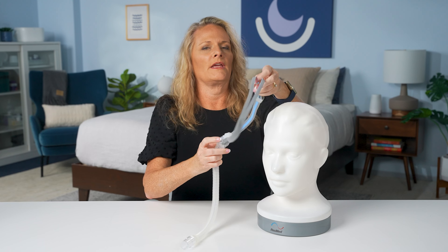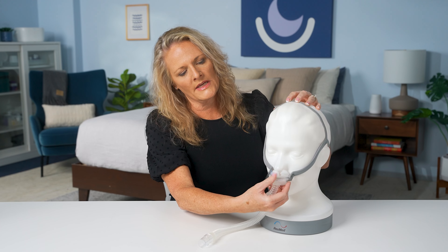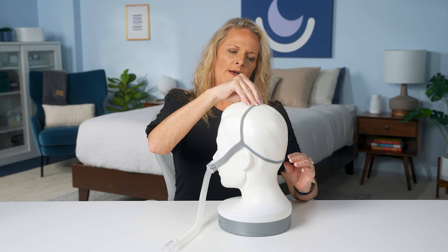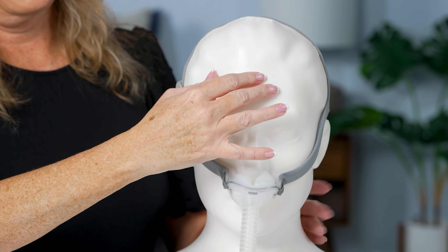Now let's go over how to properly fit a nasal pillow mask on your face. First, position the nasal pillows at the entrance to the nostrils. On this mask in particular, it indicates left and right and shows your size at the bottom, so always make sure the size is down towards the chin. Place the pillows at the entrance of the nostrils and pull the headgear to the back of the head. Make sure those are comfortable in your nostrils. Position the two straps — one at the base of the head and one at the top of the head. You can tighten the mask using the strap on the side, but make sure it's not too tight. Run your fingers around the edge of the nostrils to make sure there is no air escaping, to ensure a proper size and fit.